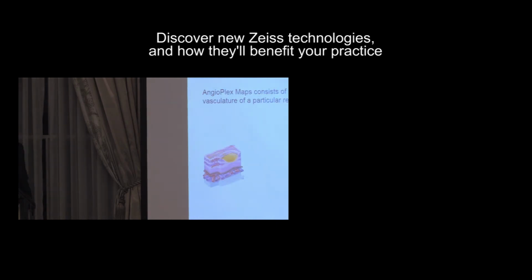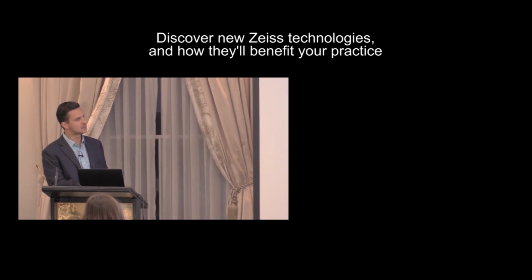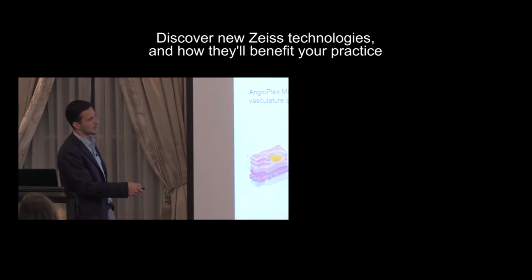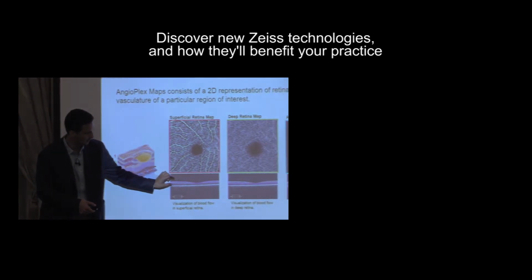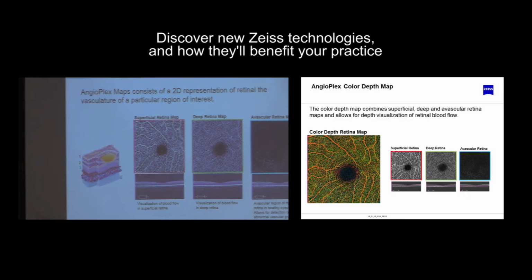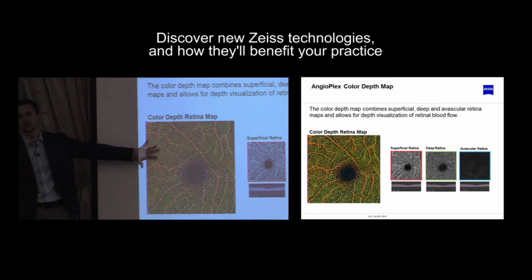Just a little bit about the scan and its acquisition. This is a great slide that shows the different areas of the different maps. You can see the red square, the green square, and the blue square going around the images. The first is the superficial retina, which on a slice is through the superficial retina in the tomogram. The second is your deep retinal map, and then an avascular retinal map. I bring that up because this is what's used when we look at this color depth imaging map.